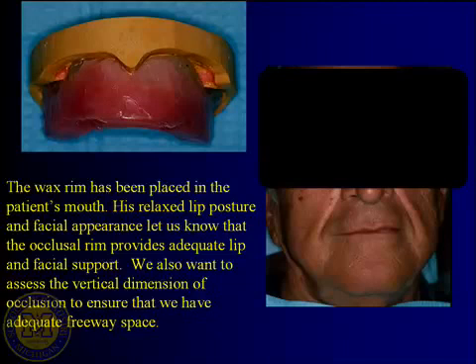So when they say the art and science of dentistry, a lot of it is science, but there are certain aspects of dentistry that we do that are subjective. And so for some people that are really made crazy by subjectivity, this is sort of a frustrating exercise many times, because there's no one hard, fast rule I'm going to give you. In general, if the wax rims are 22 millimeters tall here and 18 here, is that going to be pretty close? It is. How are you going to fine-tune that?